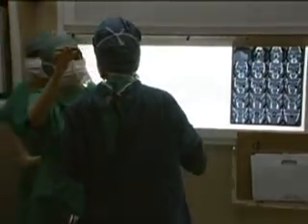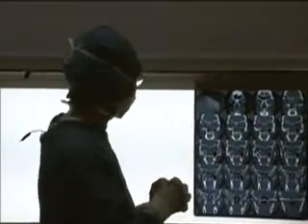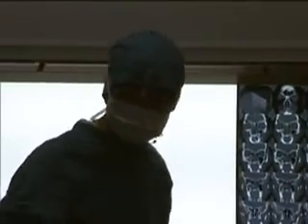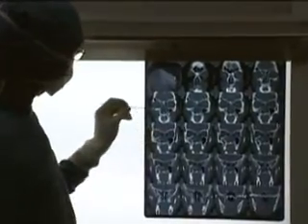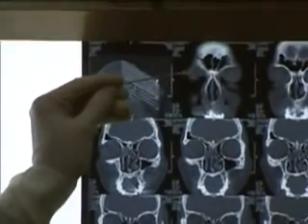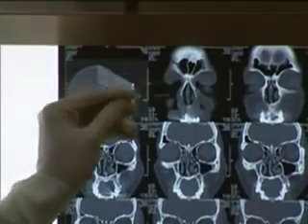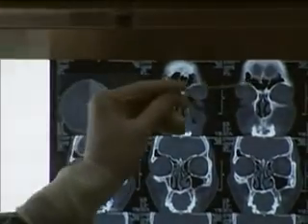Okay, Sham, we are with you. Okay, thank you, John. So you have heard from the history, this lady had a long history of right nasal obstruction and bleeding. From the CT scan, I would like to show you some important findings. Do you see the CT of the patient? Yes, we see very well. Okay, we start from the first cut. You can see the frontal sinus very well. Can you have a close-up view? Okay, the frontal sinus, well pneumatized.